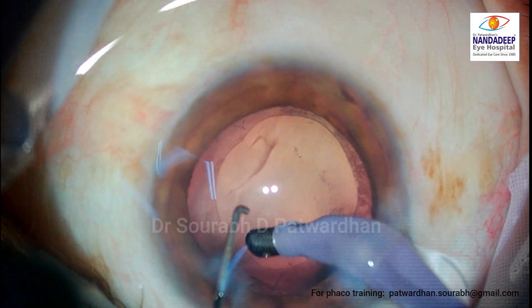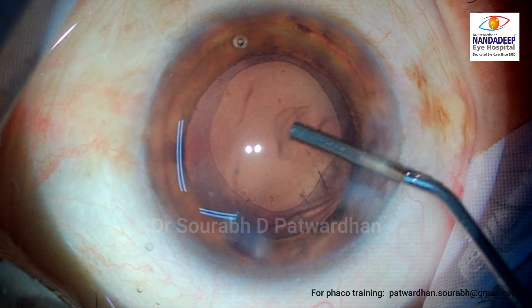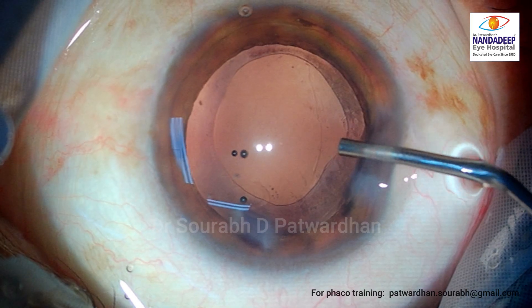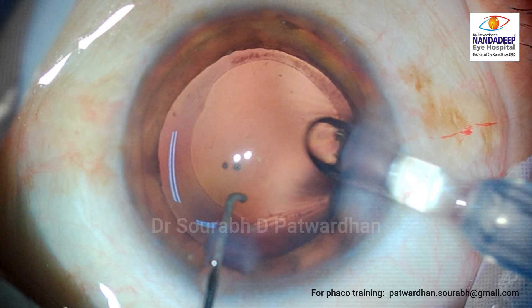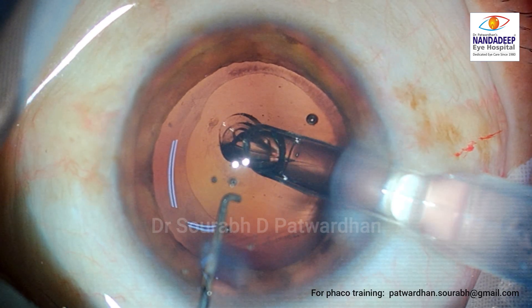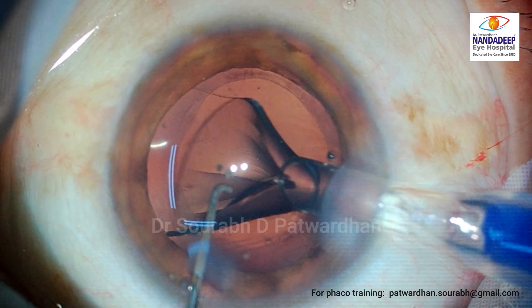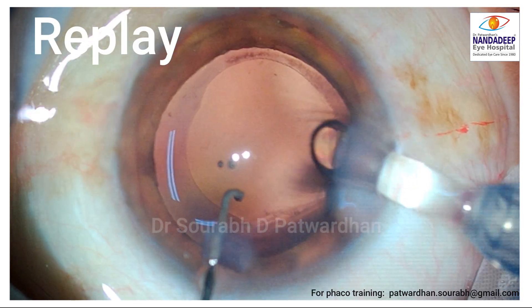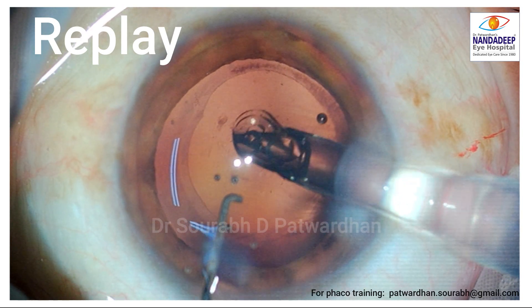The surgery till now has been uneventful. This is a soft cataract and now I am injecting viscoelastic to fill the bag. This is a Zeiss Plate Haptic trifocal IOL and I am implanting this IOL in the bag. The IOL goes nicely in the bag.